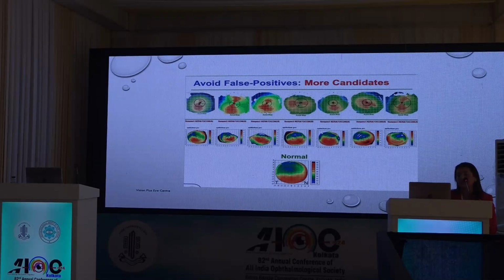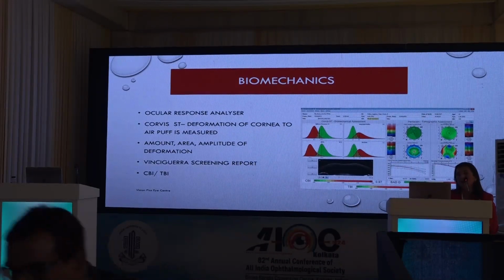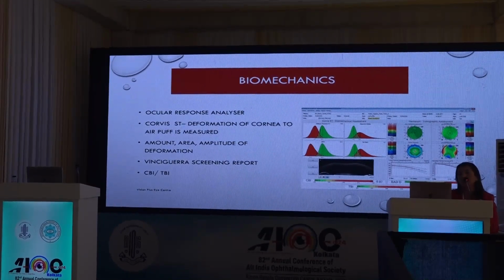So biomechanics is another very important aspect which we'll not be touching on today. But along with your topography, biomechanics now has a very important role in identifying those cases who are vulnerable and who need to be avoided as candidates for refractive surgery.